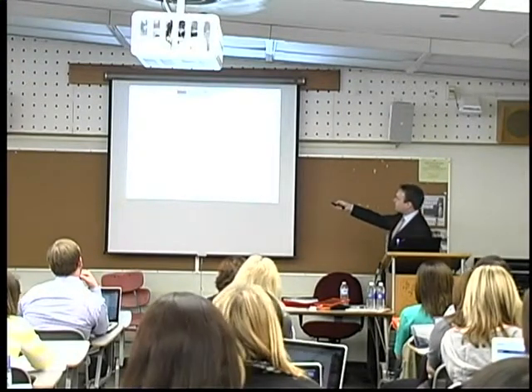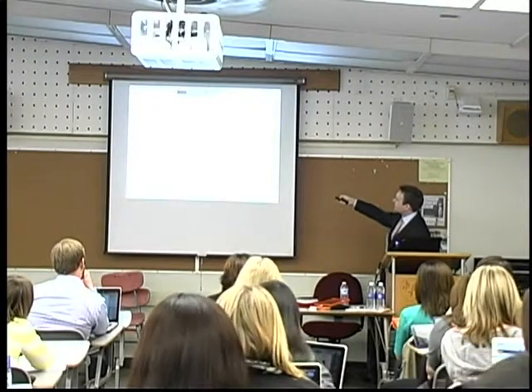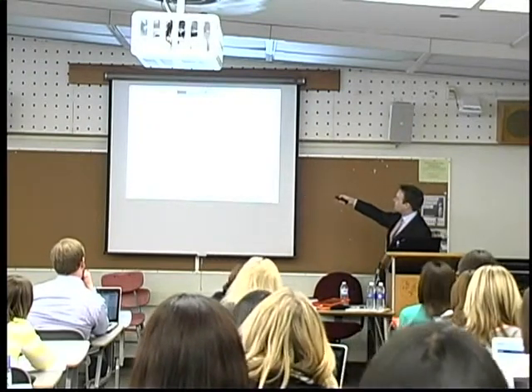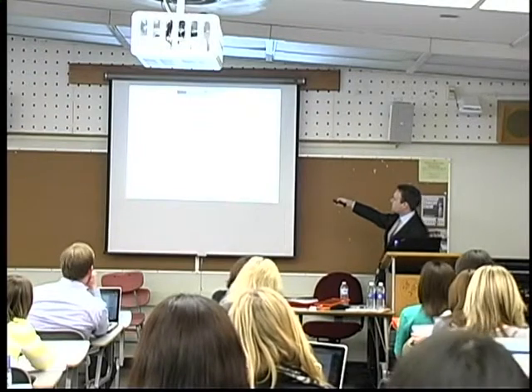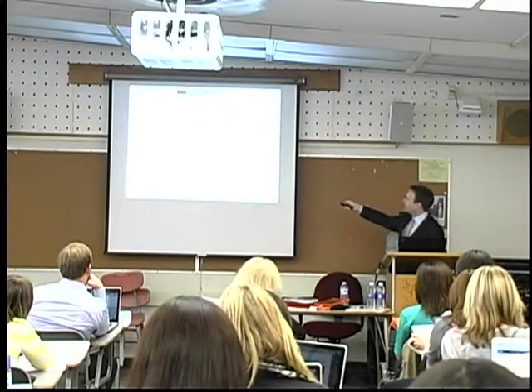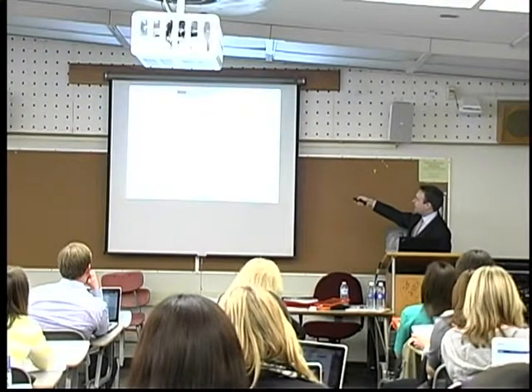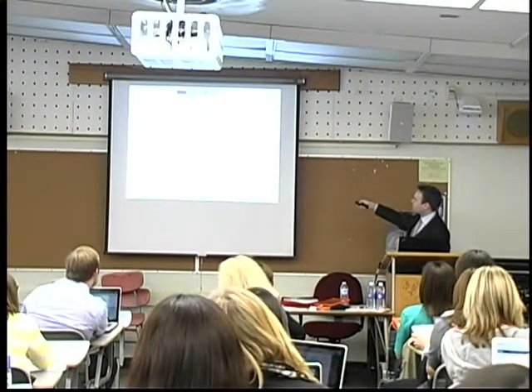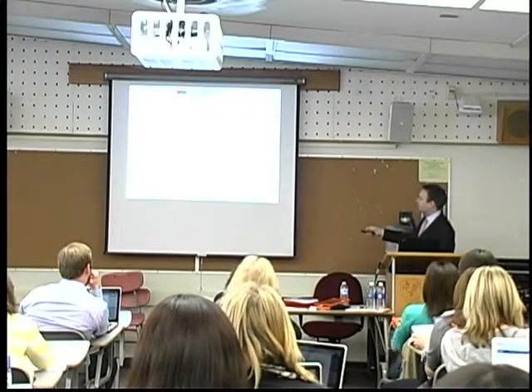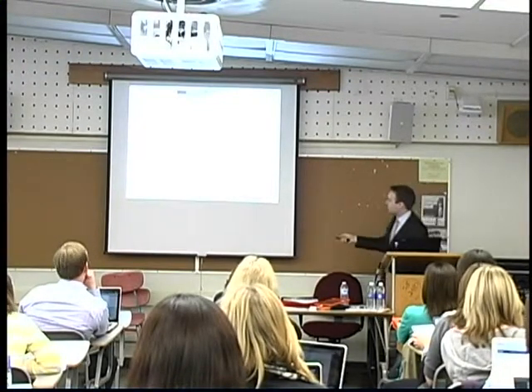The second individual also made an easy transition to the Proxtalker. It took a little bit longer to understand how to do I want sentences, and he got into this mode of answering more or less spontaneously to what do you want. This was at the end of the school year, so we didn't have a chance to try out the iPad app with either this one or with that one. But he became a communicator with the Proxtalker, used it very effectively for his requesting purposes, and also maintained those skills after the study was concluded.